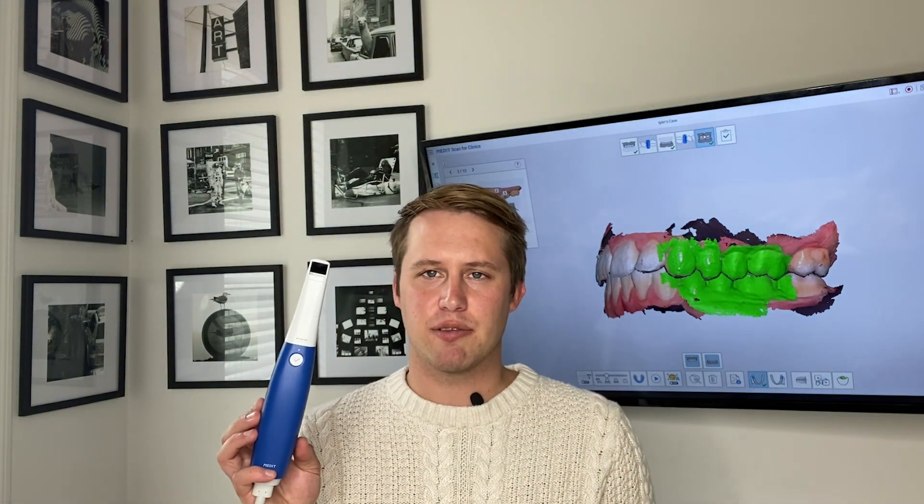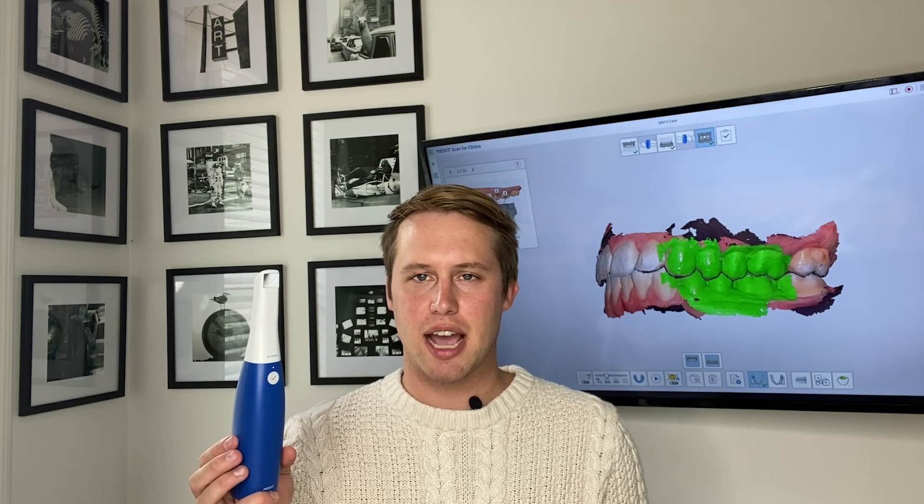So again, first time scanning with the i600 right out of the box — very easy to capture a full arch. Great color, HD images, very lightweight, very easy to use and highly recommended.